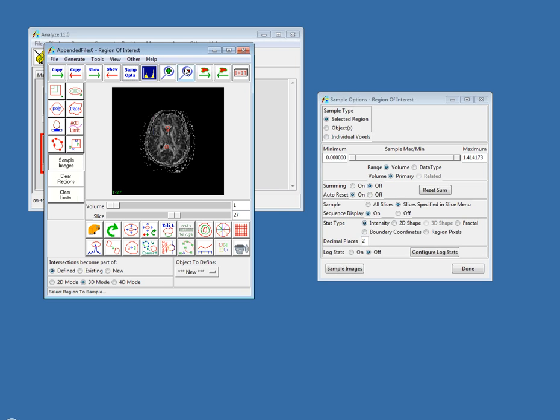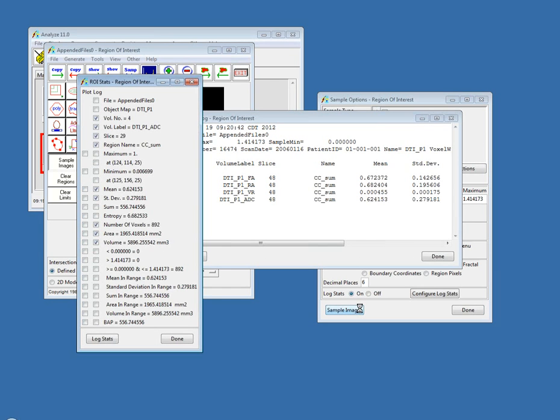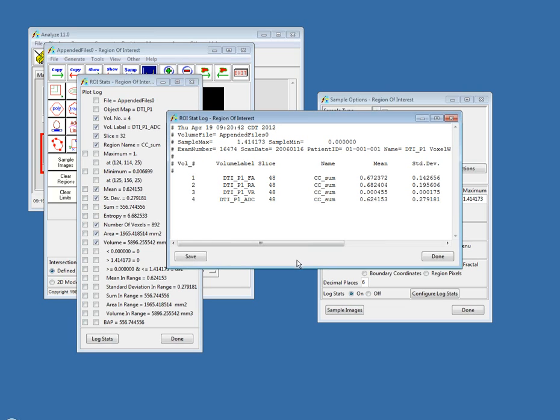I'm going to take this into the region of interest module. I'll load an object map I've already defined. If I go to the sample options window and quickly specify sampling parameters, turning log stats on so we get the log file at the end, and hit sample images — you can see in my ROI stat log we now have the original name of each one of those DTI maps. This makes it a lot easier to track which measurements are associated with which volume.